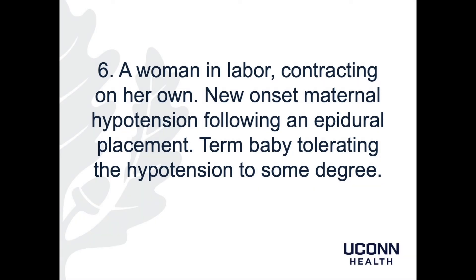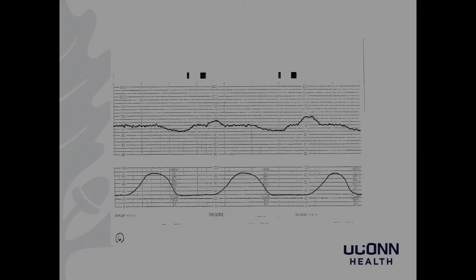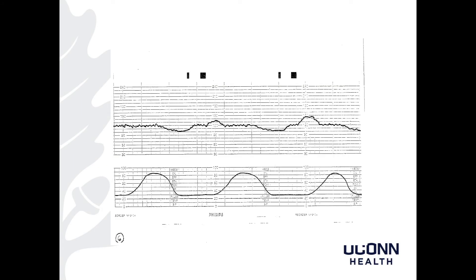Patient 6 is a woman in labor contracting on her own with new onset maternal hypotension following epidural placement. She has a term baby tolerating the hypotension to some degree. My read: baseline of 120s, moderate variability, accelerations are present, and there are positive recurrent late decelerations. This is a Category 2 tracing. You can see the late decelerations after every contraction, and also two accelerations — one in the middle and one to the right of the tracing.